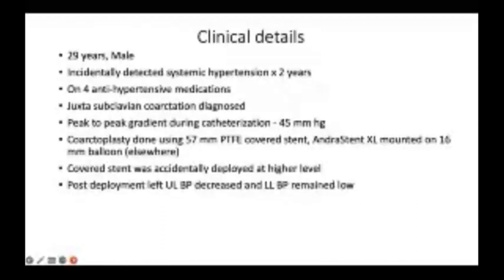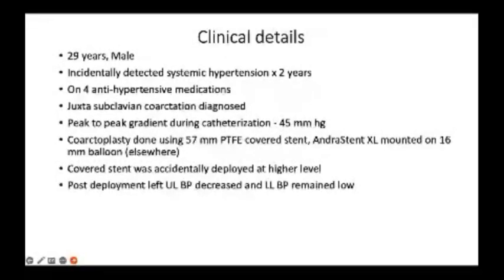The CT showed a Gothic aortic arch, and the aortic dimensions were 18 mm at the left subclavian margin, 8 mm at the distal isthmus, 4 mm at the level of coarctation, and 26 mm beyond the coarctation. The coarcting segment was 25 mm beyond the left subclavian margin.